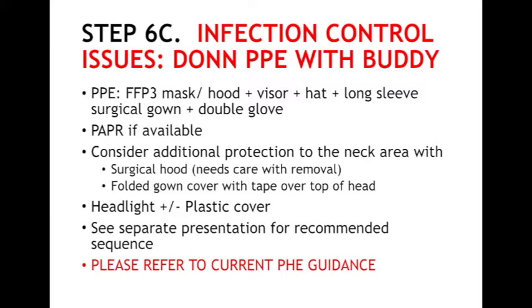Dependent on the operative environment, a headlight may be required. Non-disposable ones should be covered with a plastic bag such as a swab bag, which is only semi-opaque and freely available. The donning and doffing of this additional PPE has been covered in a separate presentation. We would always recommend a referral to local and national guidance for PPE requirements.